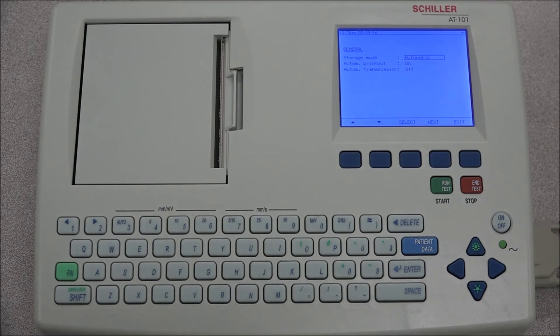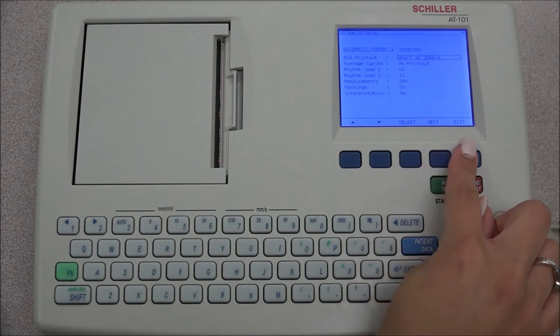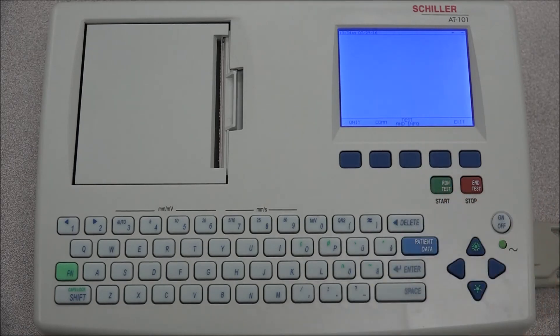Under system settings, you have several options. Under unit, you have various parameters. The user ID is where the identification of the user is inserted. This identification is printed on all automatic recordings. The time, date, and language are defined under the unit tab.